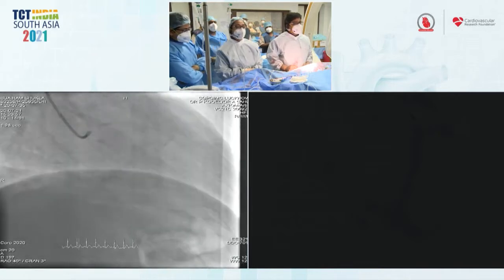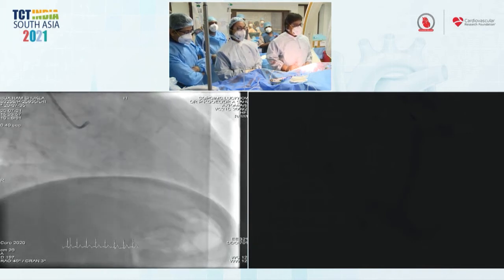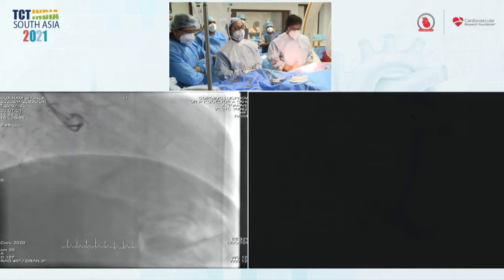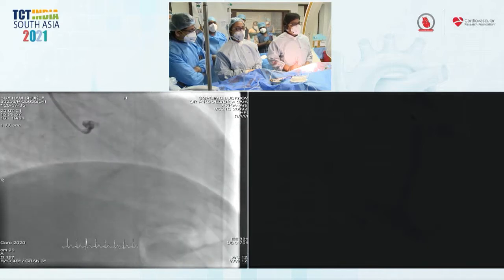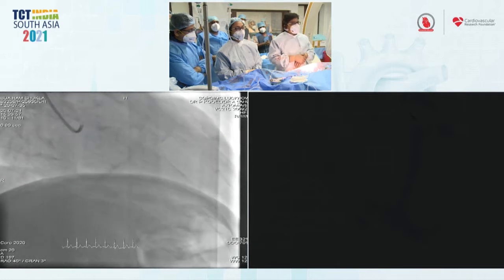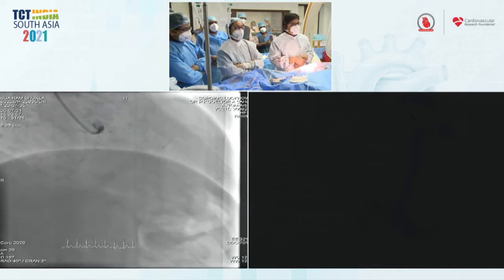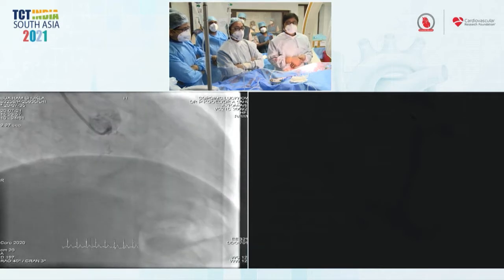So a challenging case, with a good clinical indication of progressive angina over time that's uncontrolled with medical management. I think you have a number of challenges in this case. Obviously, the J-CTO score here is high. You have an ambiguous cap and a long lesion. Unfortunately, the assessment of your collateral circulation is limited by your high-grade LAD lesion, and also there is a lot of panning in the original angiogram. But I do think that you can tackle this with a hybrid approach.